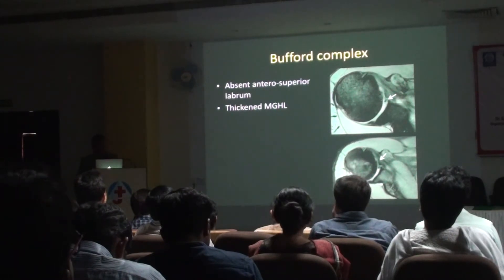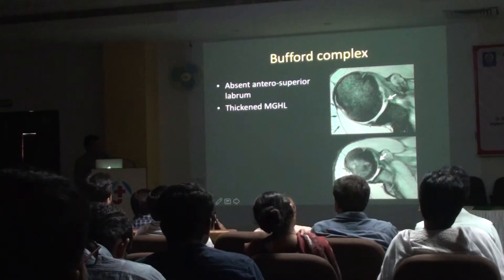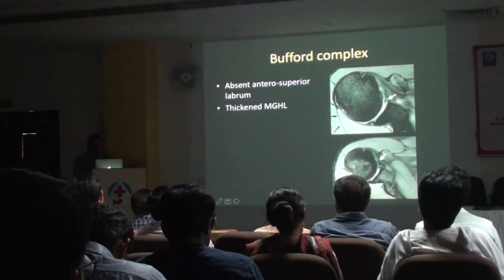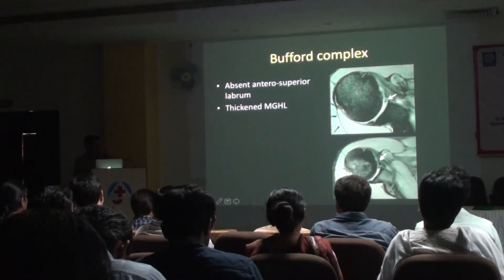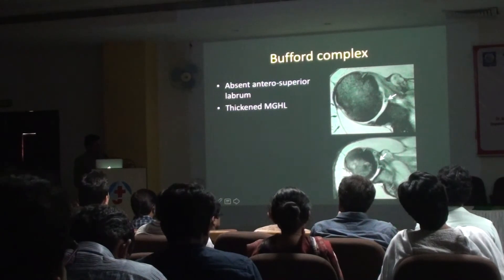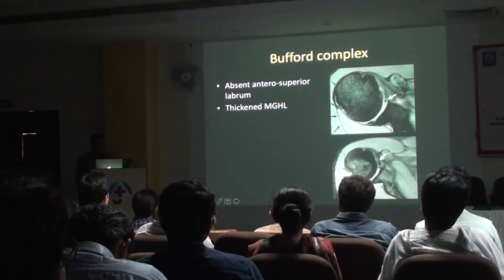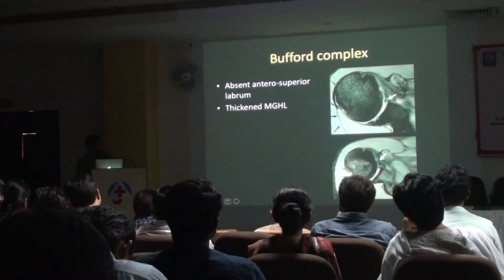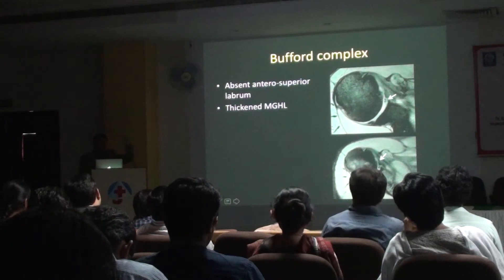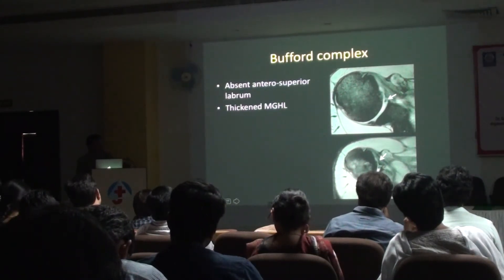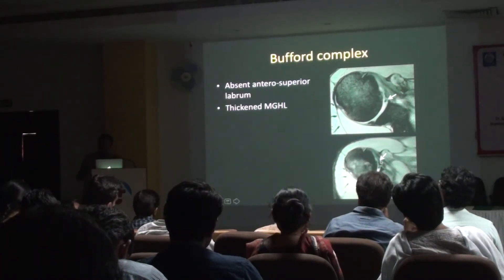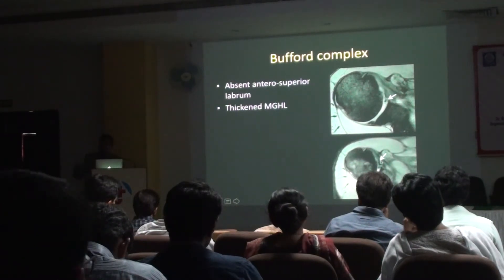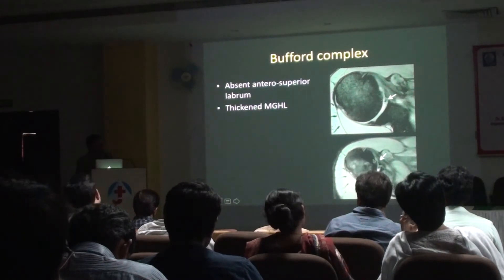The Buford complex is another normal anatomical variant. When scrolling through, normally you see the posterior labrum as a black structure, and you should see a similar black thing anteriorly — but you're not able to see it. There is an absent antero-superior labrum. But if you come down, you see a big, cord-like thickened MGHL. Whenever you don't see labrum antero-superiorly, your eye should automatically go to the lower cuts to check the MGHL. If the MGHL is normal in size, it's not a Buford complex — then think about whether you're dealing with an antero-superior labral tear. If it's cord-like and thickened, that's a Buford complex.